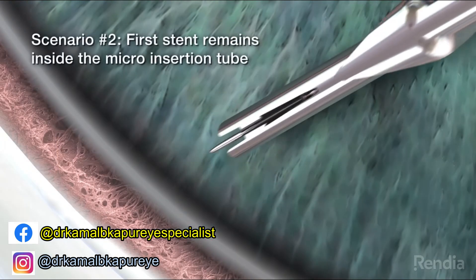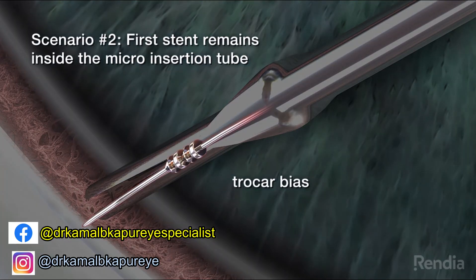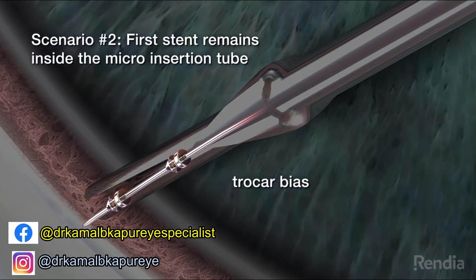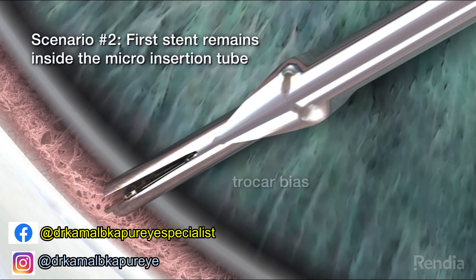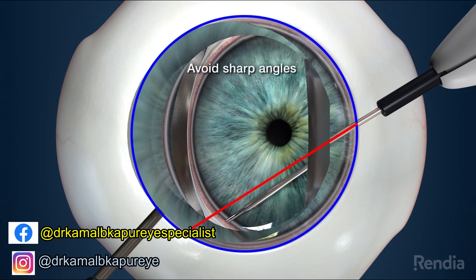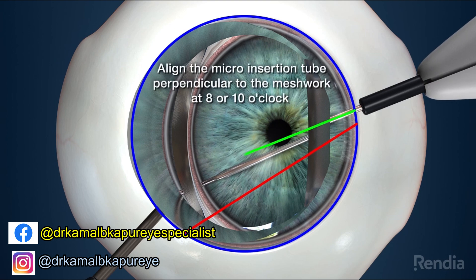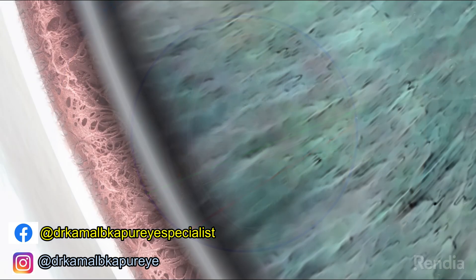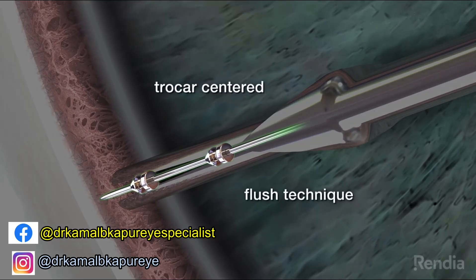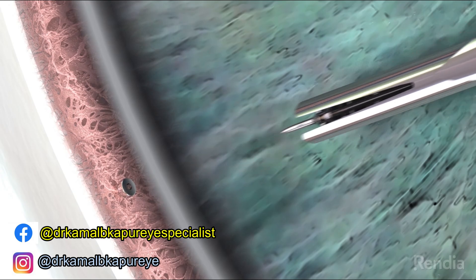A false pass can happen when, after insertion, you suddenly tilt the trocar, causing the stent to become stuck within the lumen of the trocar — resulting in misfiring or misplacement. Therefore, you always have to make sure that the line of entry is in a straight line to the line of implantation. Any tilt in either direction will cause a bias and result in incomplete penetration of the stent.